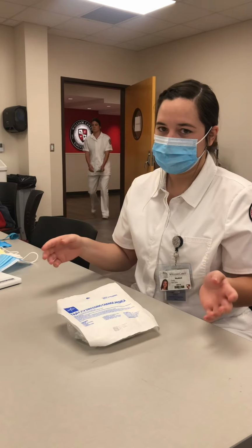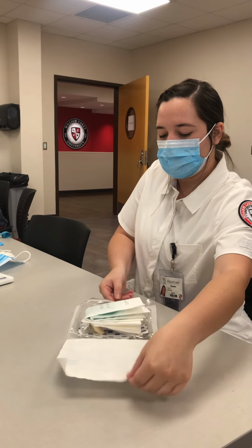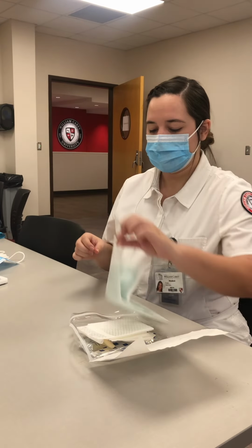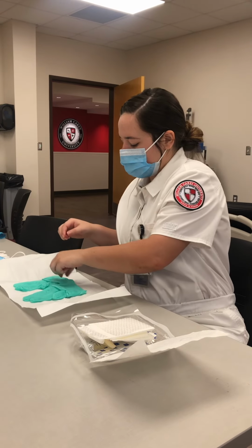And now we're about to get into the sterile field. So we're going to open our equipment away from us, making sure that that stays down. And we're going to take our sterile gloves out and put these on.